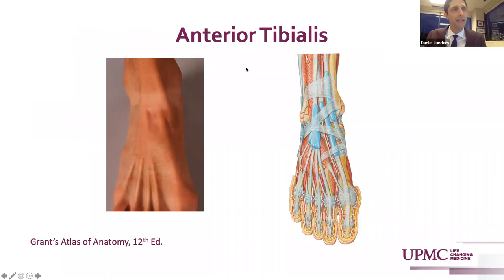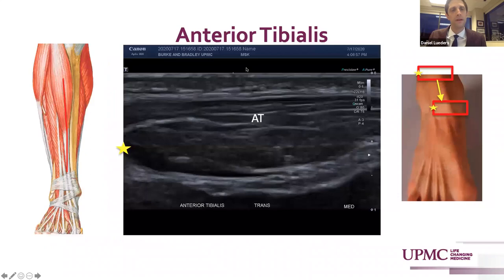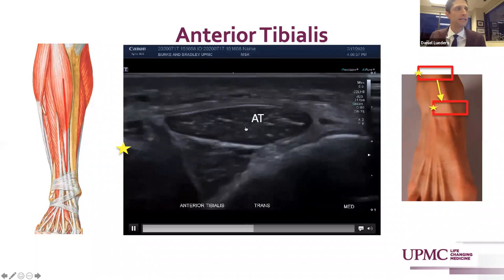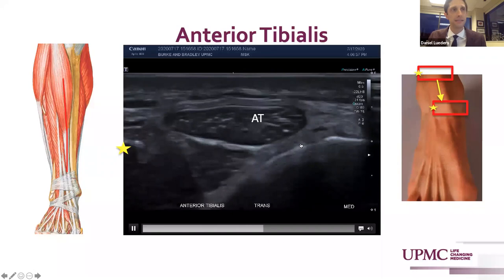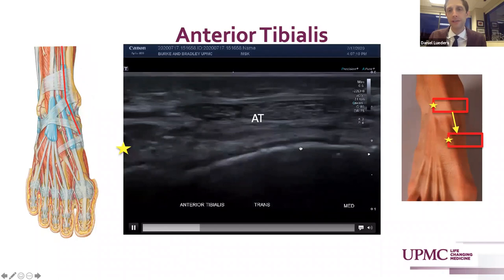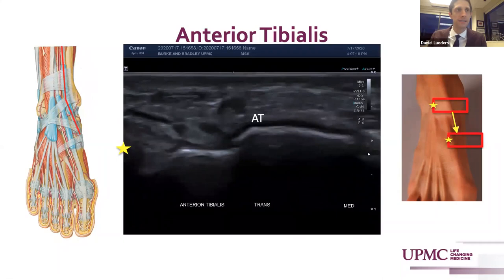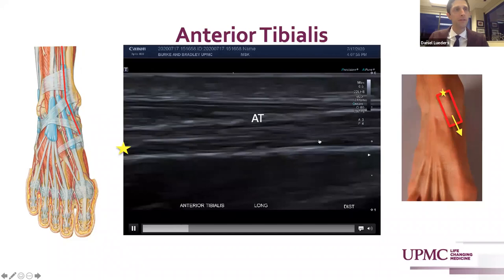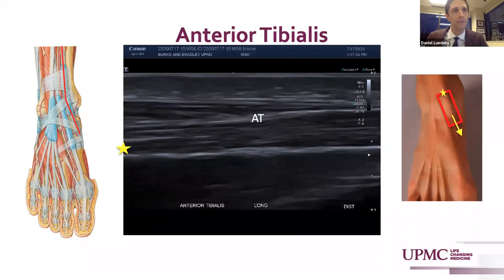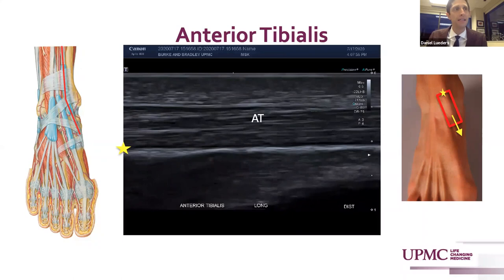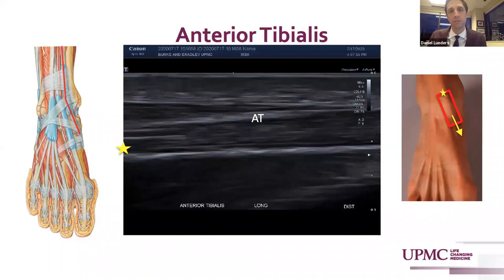The anterior tibialis is the largest tendon in the anterior ankle. It's held down by the superior retinaculum. It courses across the anterior medial leg adjacent to the tibia and becomes a large hyperechoic ovoid-looking tendon in the anterior leg adjacent to the medial tibia. As it courses over the anterior ankle joint, it maintains that densely hyperechoic ovoid shape until it flattens toward its distal navicular insertion. It should also be evaluated in long axis, where the anterior tibialis maintains its same caliber of densely packed laminar appearing hyperechoic tendon fibers. Any bulbous deformity or swelling or peritendinous fluid would suggest a tenosynovitis or tendinosis.